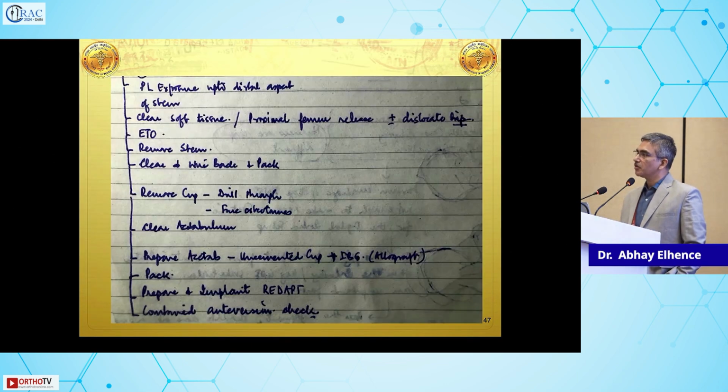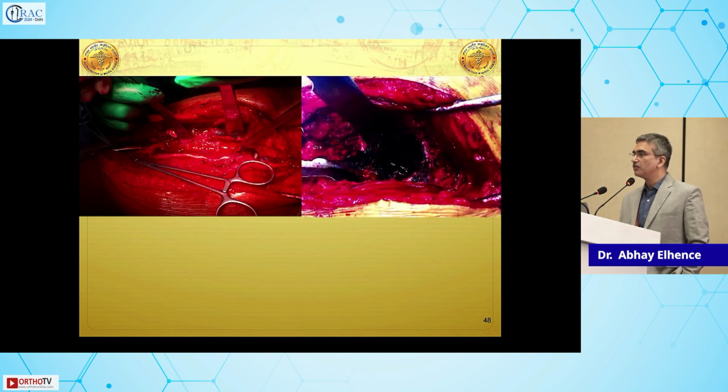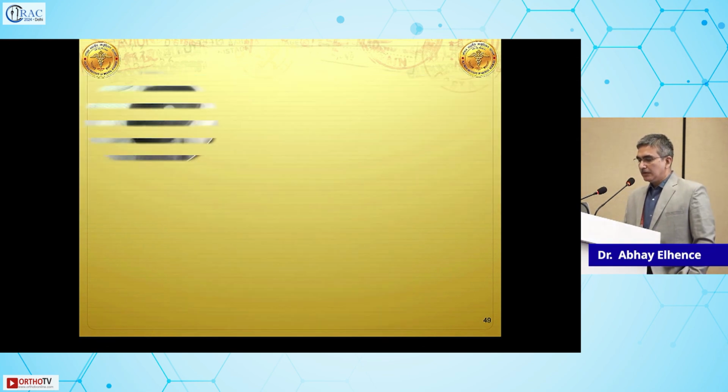You have to be on the drawing board, plan your hip well, choose your steps, write them down, think them over before you do procedures, which will take a little more time than what your normal hip and knee will.